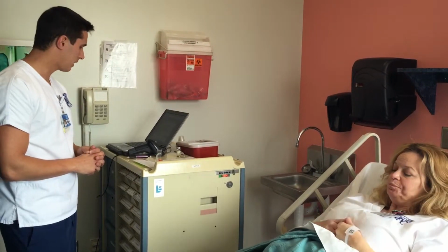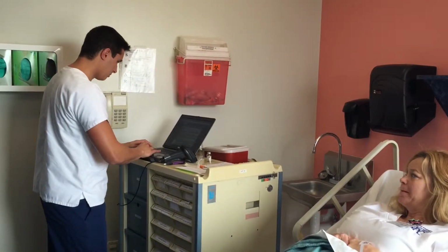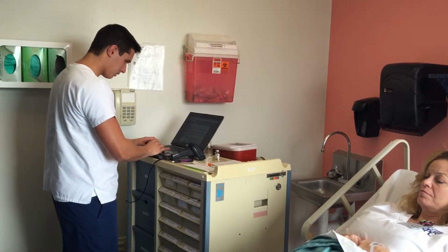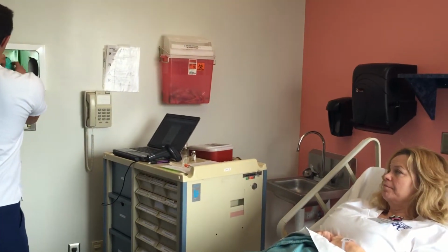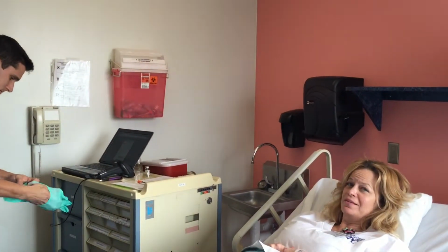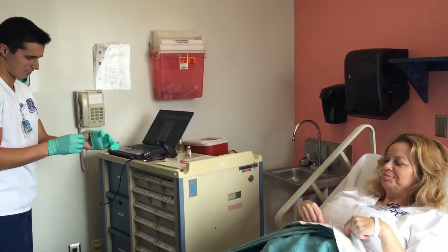Perfect. I'm gonna get ready here. I already drew your insulin. It's a regular insulin. It's prescribed for 17. Okay, we're getting there. I've been poked so many times since I've been in this hospital, but these are small needles, so it's good.